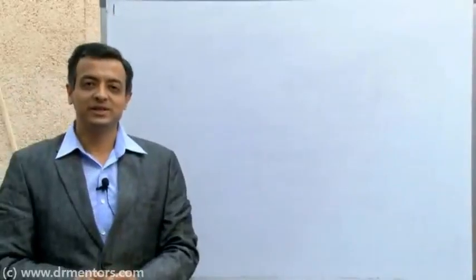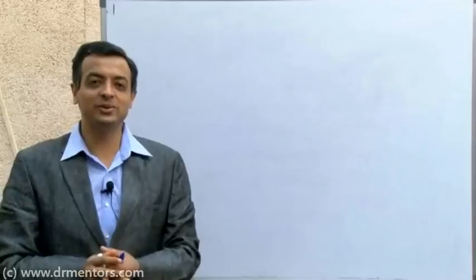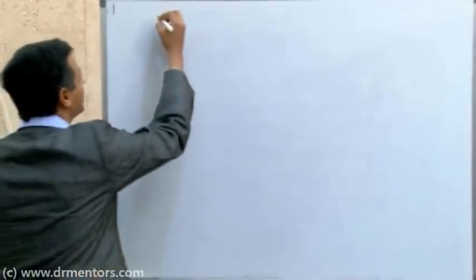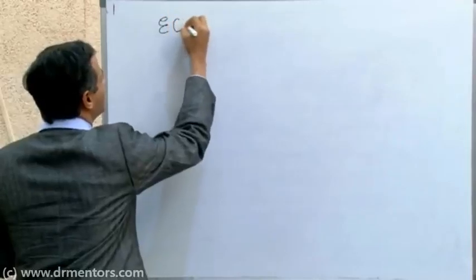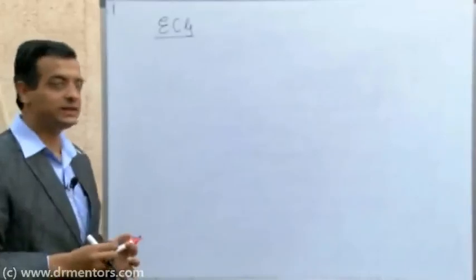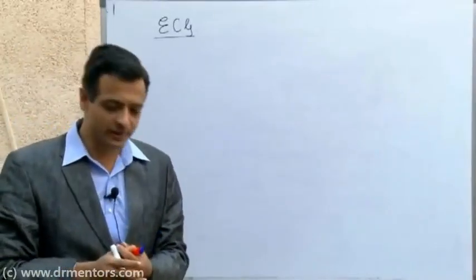So welcome to this session on ECG, electrocardiogram, something that everybody wants to know because it is such a vital, common investigation and treasure of information about the heart. So what does the ECG do and how should we study the ECG is a very important question.